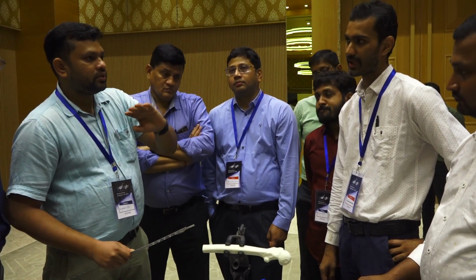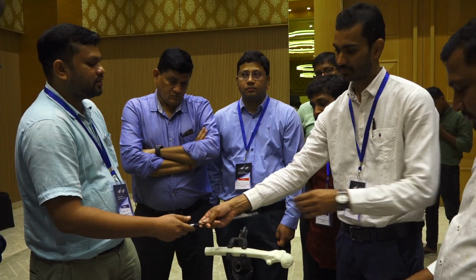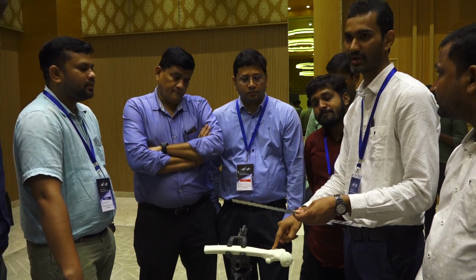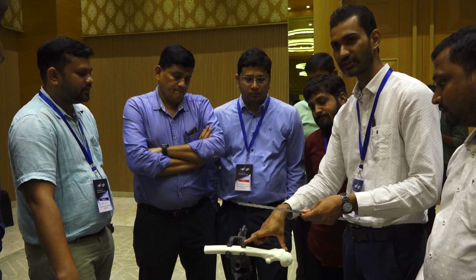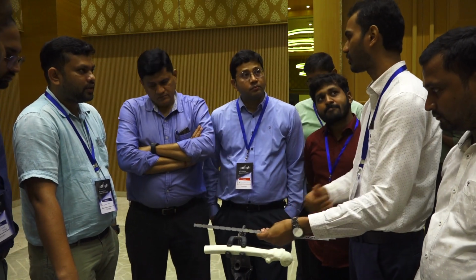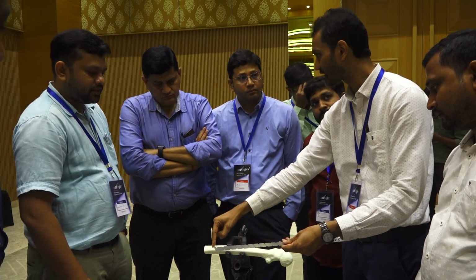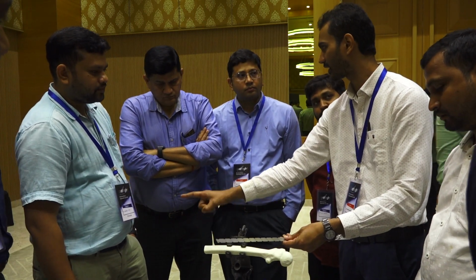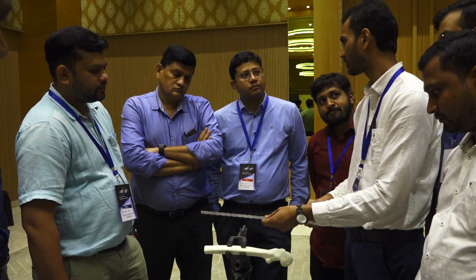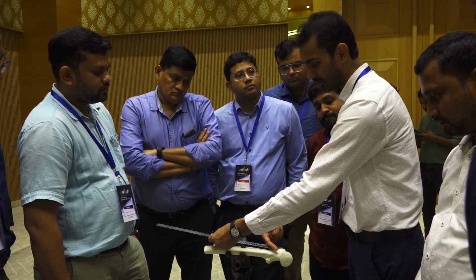Even if it is a 360 or 380 nail in an intertrochanteric or subtrochanteric fracture, this portion will not cause much problem. But in mid shaft or distal 1/3, we have to take the exact nail length, so in that case there will be an issue. But 360, 380, 400 will not cause much issue compared to this, because after putting the nail, we will only keep the nail according to this position.